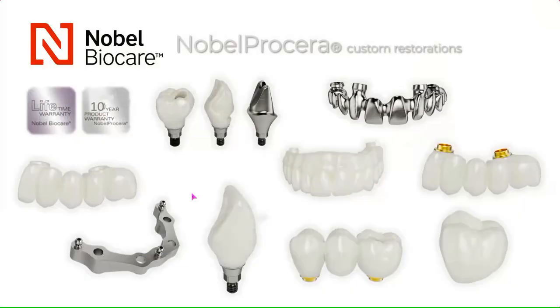We'll dive into that a little bit, but will include, of course, the implant bridges in zirconia and titanium, custom abutments, screw retained crowns, our titanium overdenture bars as well. And with these products, it will either be a lifetime or 10-year product warranty because our manufacturing process allows us to do this. So even if this is placed in the patient's mouth up to 10 years, we will replace that restoration. So with our manufacturing process with NobelProcera, we're able to do that.